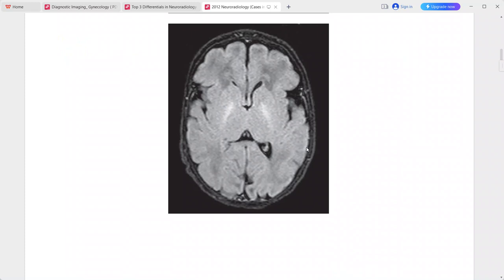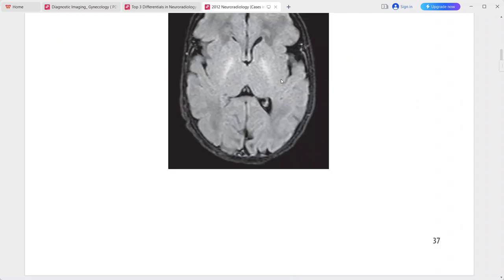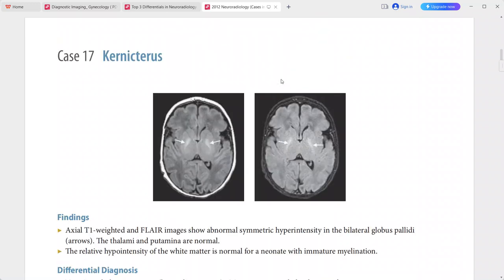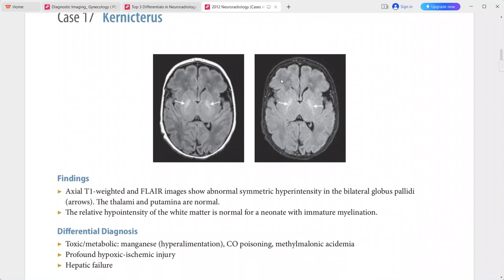The relative hypointensity of the white matter is normal for a neonate with immature myelination. The main diagnosis is kernicterus. Differentials include toxic-metabolic causes, manganese hyperalimentation, carbon monoxide poisoning, methylmalonic acidemia, profound hypoxic-ischemic injury, and hepatic failure.